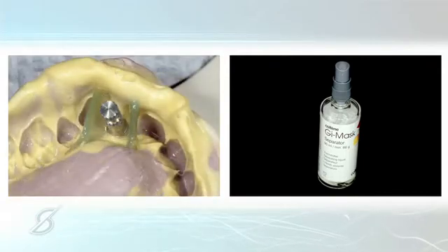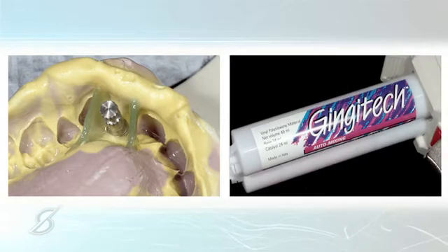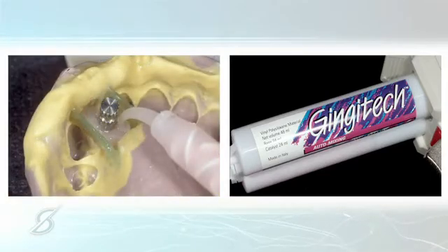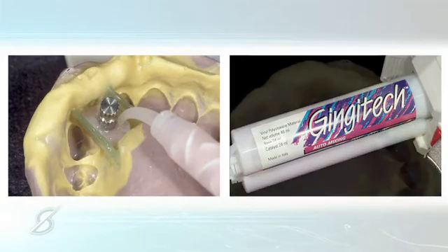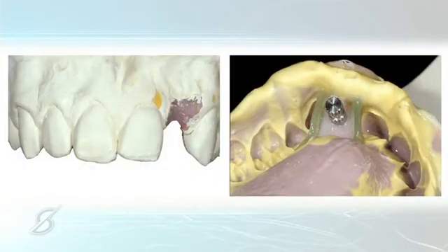You spray that onto the abutment and the impression, and then this product was Gingitech, a pink silicone that's injected down into that little boxed-in area, making sure you leave the lab analog sticking up so that when you pour stone, the lab analog is locked in stone. Basically, that's how we get our model that we're now going to make our temporary on.